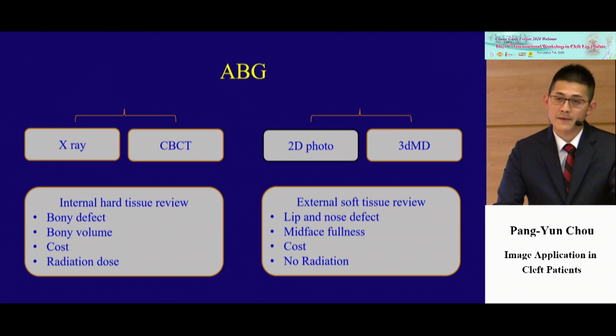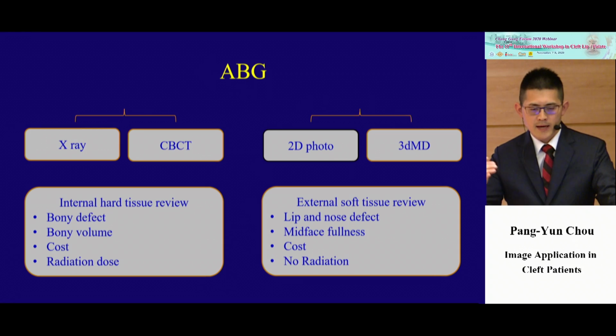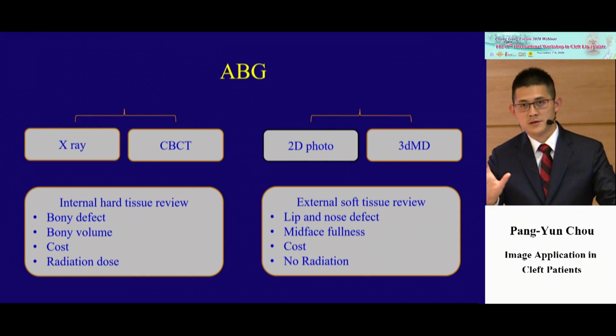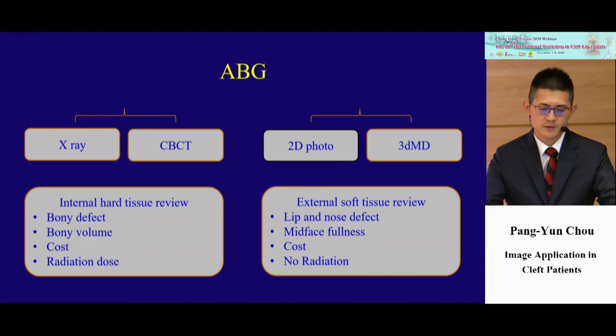And then you may have to consider the radiation dose. Is the radiation dose too high, or is it acceptable for this kind of preliminary study? The next is to look at the external facial appearance. So you can check currently how the defect is between the lip and nose, and then we can check the mid-face fullness.